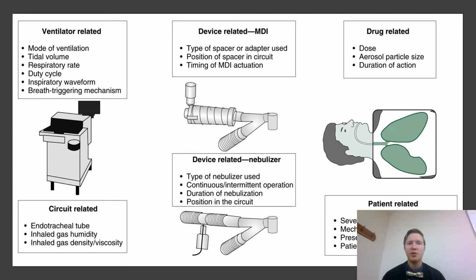All right, so what are some of the different things that we have to be considerate of? And you'll see this in the PowerPoint, right? The ventilator related issues are the mode of the ventilation. Are they in spontaneous mode, pressure support mode? Are they in a full support mode, partial support mode? Are they in a mode where their breathing is not uniform and deep, right? That will affect deposition.